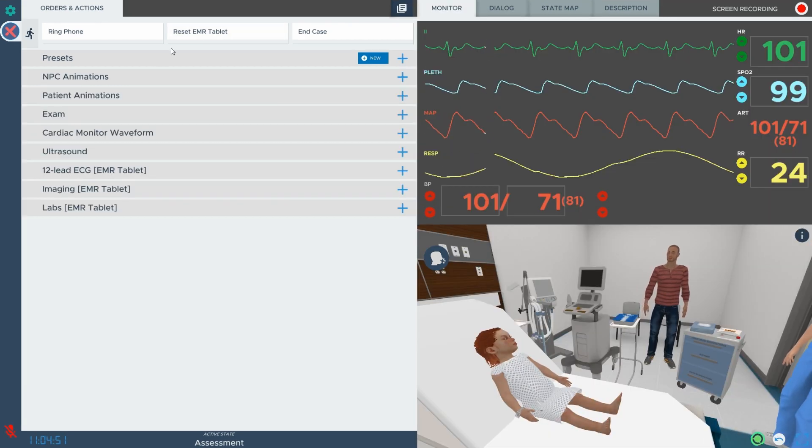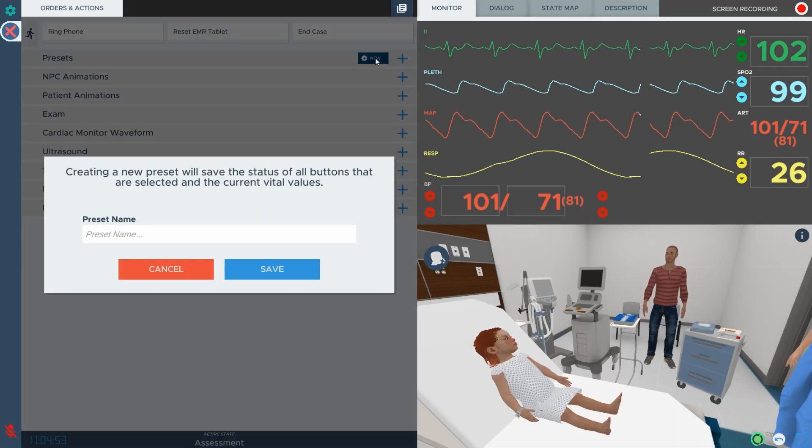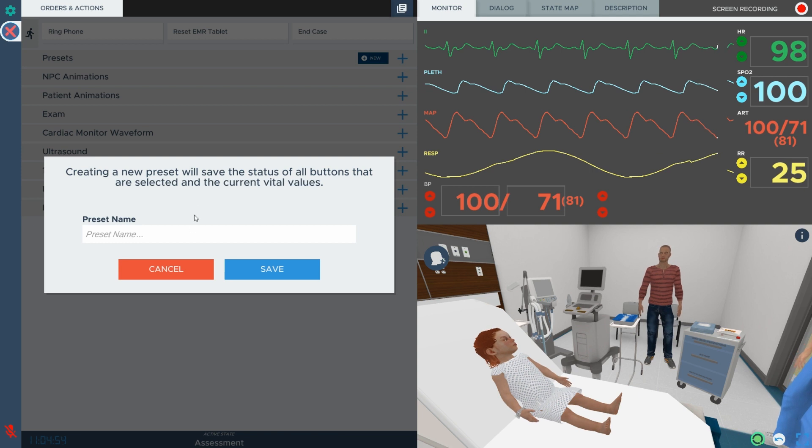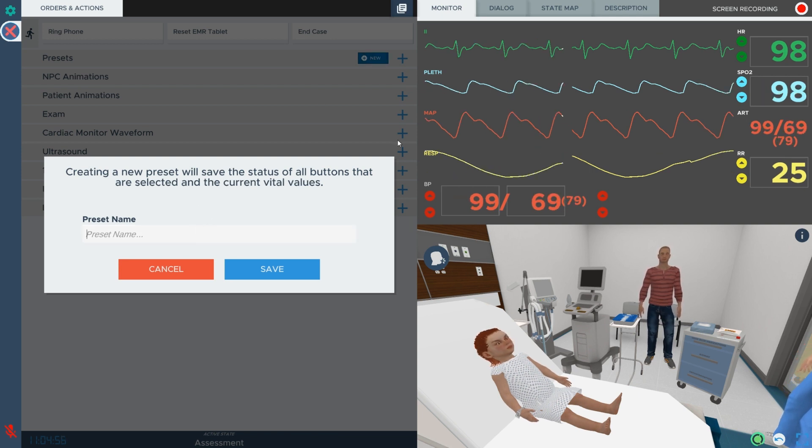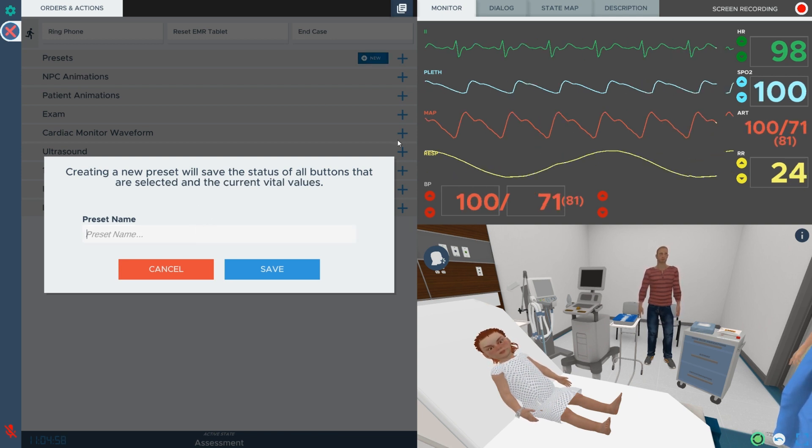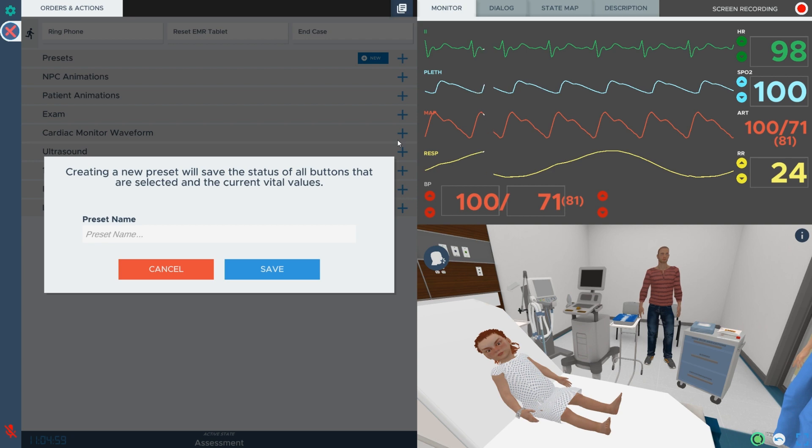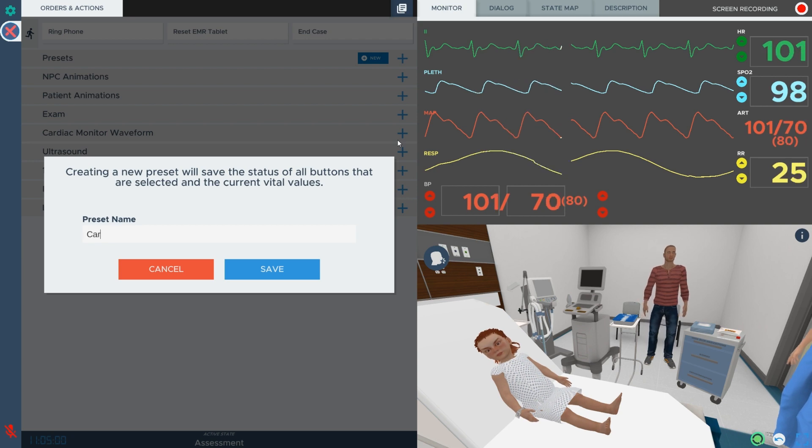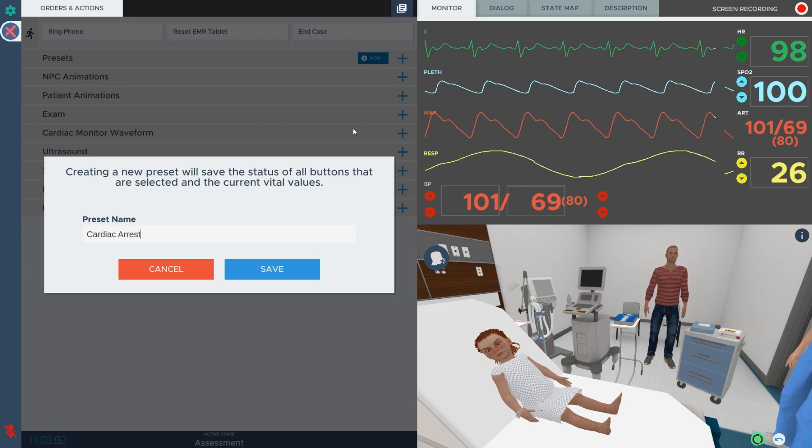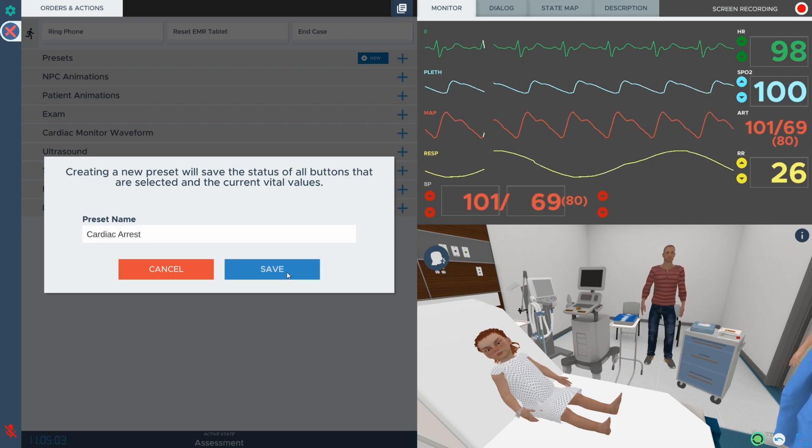If you would like to create your own combination of exam findings and results, our intuitive interface gives you control of the patient's presentation and simulation flow, allowing you to tailor the simulation experience to your learner's needs.